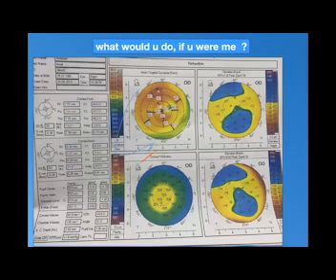What's your opinion on studying this Pentacam? What will you decide after the slides we talked about? The K1 is 44.6. The K2 is 48, right? The K max is 50.1.